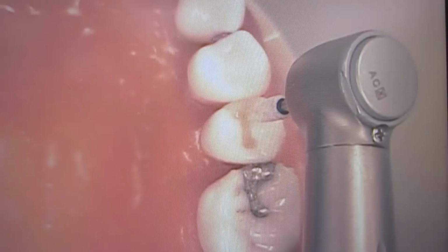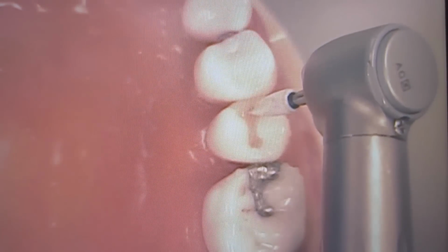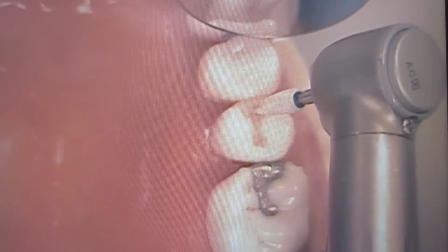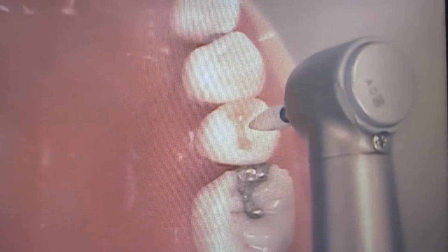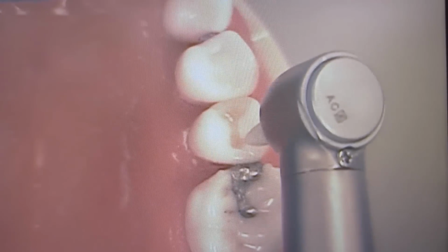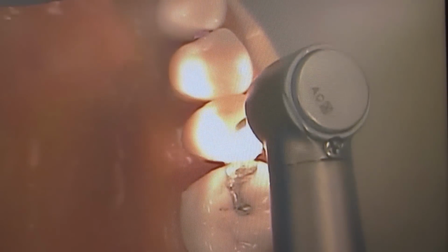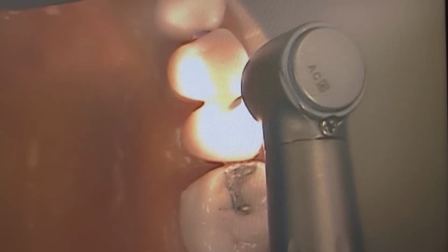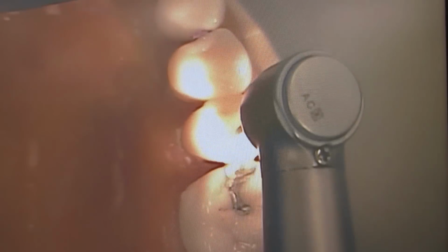He said, well, you can obviously either drop the rest of it. Yeah, I can see that. And then he also mentioned that you could. Okay, the angulation. So you're resting on the enamel? Correct. And I'm only going to use the very tip of it. So anyway, for the exam, he said, well, you could fix the class 2. Class 2 in the box. Yeah, you're going way back.